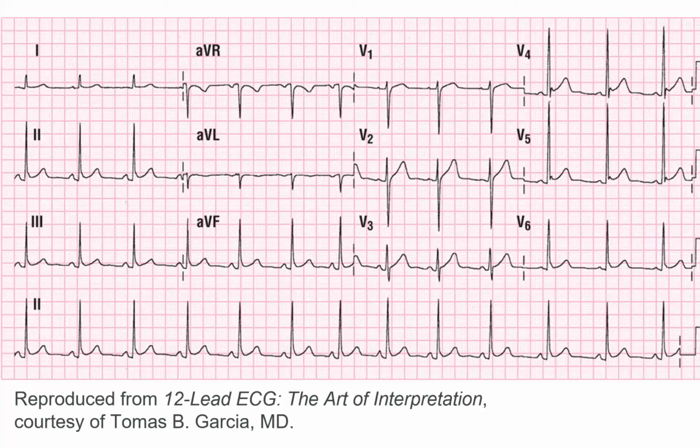We go to V1. Elevation, depression, or neutral? Where are we at? V1? Neutral. Okay, yeah, there might be a hair, but it's not a lot. 2. Neutral. Is that not elevation? Well, there probably is, but we need 2 full boxes. So right in here is where that thing starts to turn sideways. Somewhere in there it starts to turn sideways. Starts to go that way, maybe a little higher. Starts to go that way. But I don't think we have 2 full boxes. Close. V3?